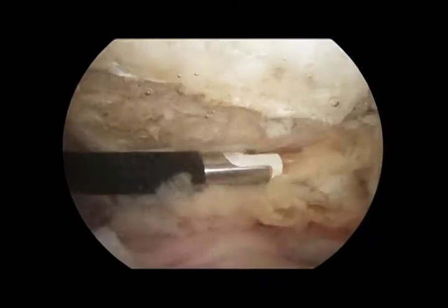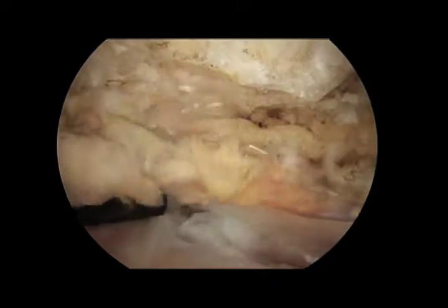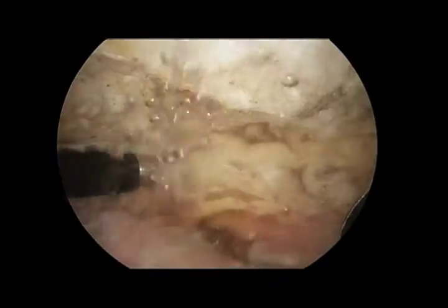Now viewing from the lateral portal, soft tissue is again debrided using electrocautery, exposing the undersurface of the acromion, the bursal surface of the cuff, and the AC joint. By taking advantage of the watershed zones between the various arteries supplying these regions, we are able to perform this debridement in a bloodless manner.